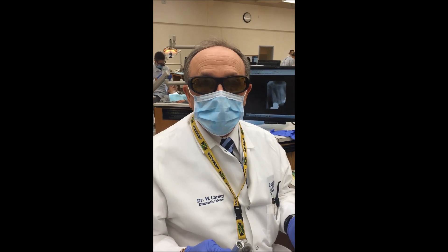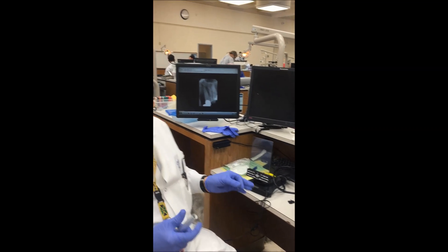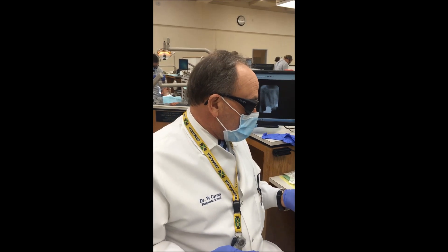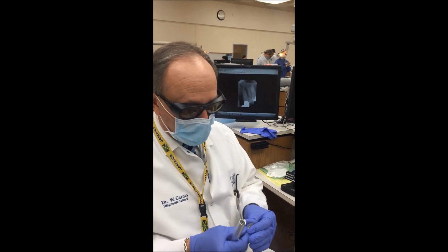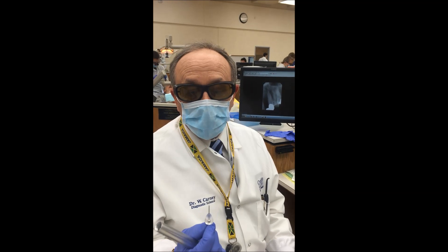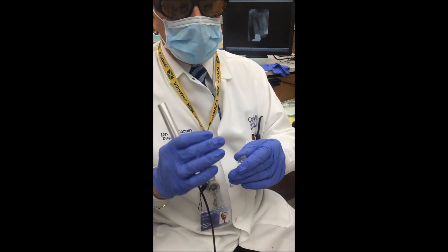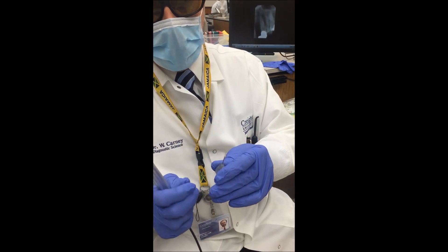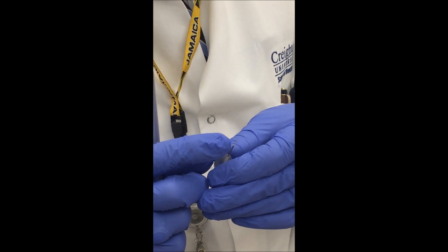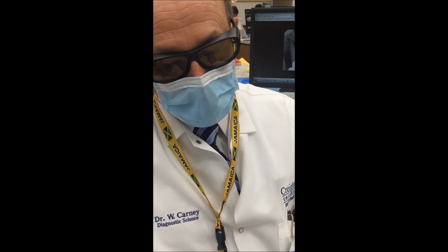Today we're going to do a demonstration of the Gemini Dual Wavelength Diode Laser from UltraDent. Setup is fairly simple and straightforward. The tips come either initiated, pre-initiated, or uninitiated. Initiation basically means that you're building up a carbon layer on the outside of the fiber optic light pipe to concentrate the laser energy at the point of the light guide.